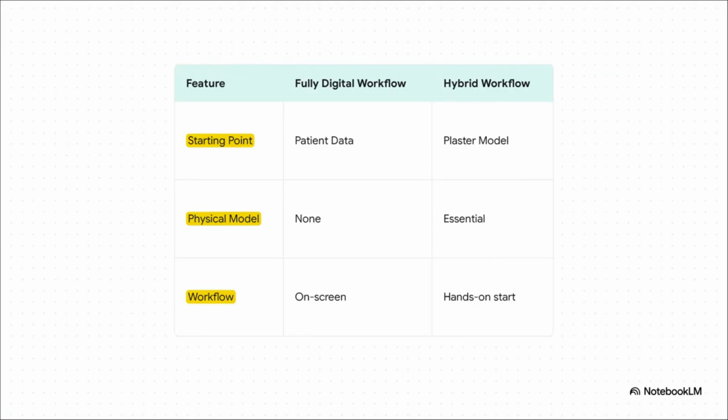And this really lays out the difference perfectly. The fully digital path starts with the patient and lives completely inside the computer. The hybrid path, though, starts with that physical plaster model, something a technician can actually touch. Both ways work great. It just gives clinics the option to choose the workflow that they're most comfortable with.